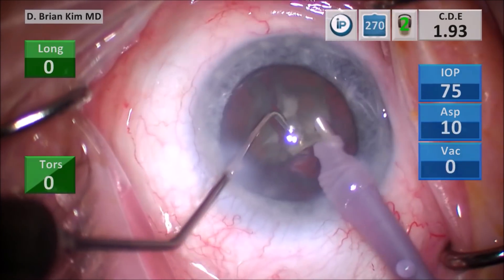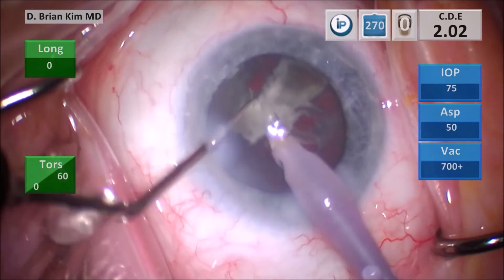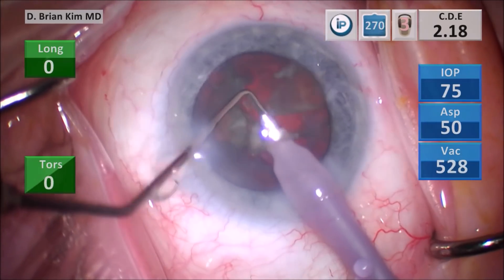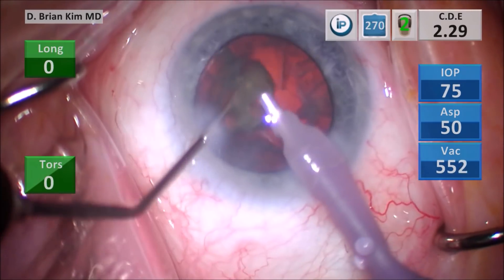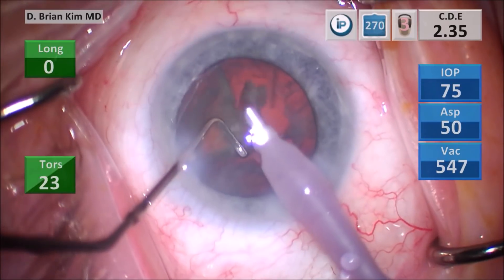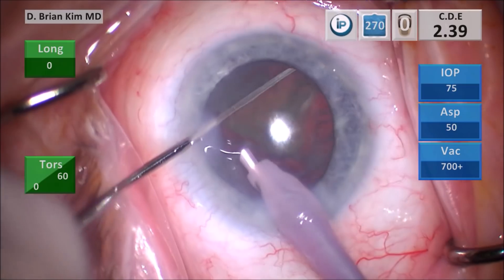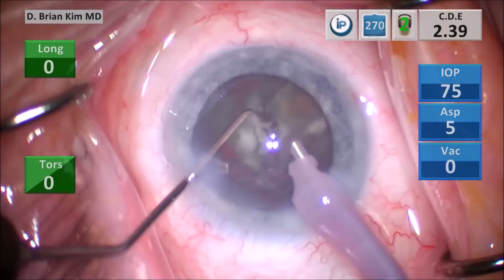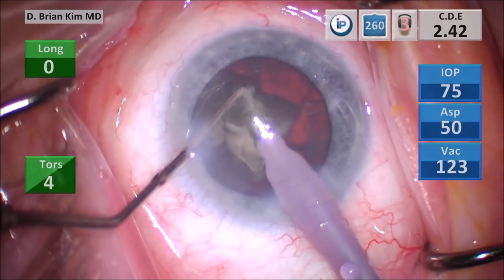I go ahead and place the chopper out again and crush another piece. When the bag is this empty, you could really use any approach, but I still like to use the same techniques because it just forms good habits. You're placing the chopper out to the equator, placing the phaco tip deep — this helps sandwich the lens material nicely and crushes it completely. You continue to sandwich the lens pieces into small bite-sized pieces, pulsing with the ultrasound and the vacuum to emulsify the lens material. For this last quadrant, I'm directing the instruments very carefully between the lens material to enable the vector forces to be the most efficient.